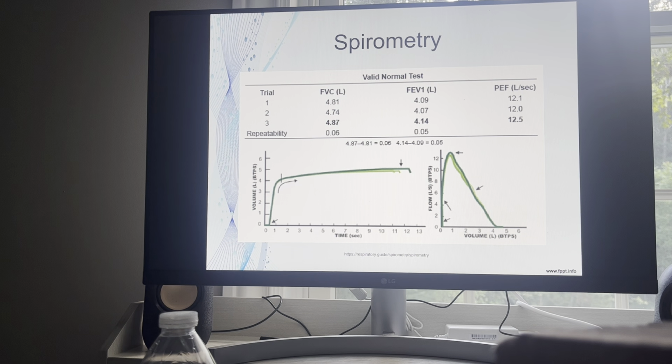And here's just another example of the results you may get from a specific spirometer. Notice you get the chart, you get the time ramp, but then with the flow loop, it's only the expiratory phase, and the x-axis is ascending instead of descending. But that's okay, because we put all of these together. We don't just look at one component. And honestly, for the most part, it's going to be the chart that gives you the most information.